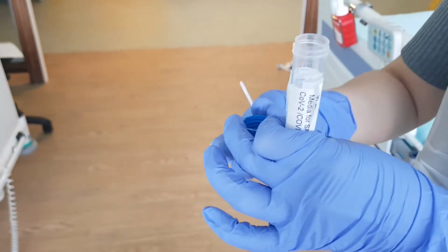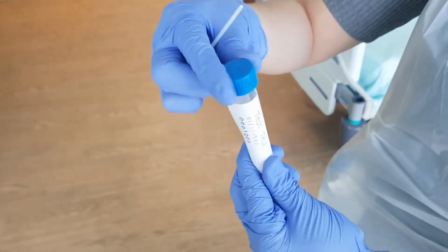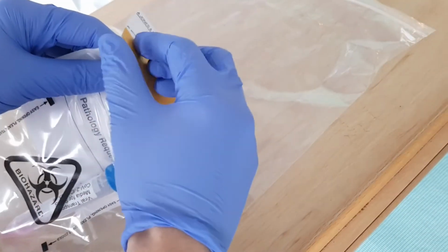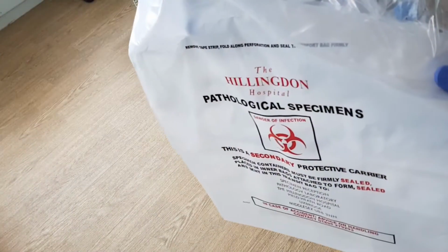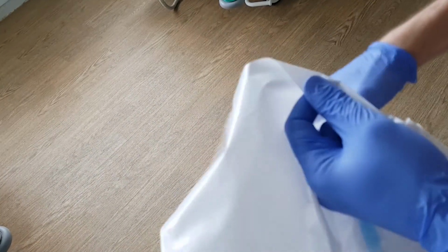The container has a liquid for sample analysis. Do not get rid of this medium and make sure that the collection tube is closed tightly and properly. Place the tube in the pathology specimen bag and then the resealable bag and close. Place the bag and one of the copies of the request inside the white bag and close.